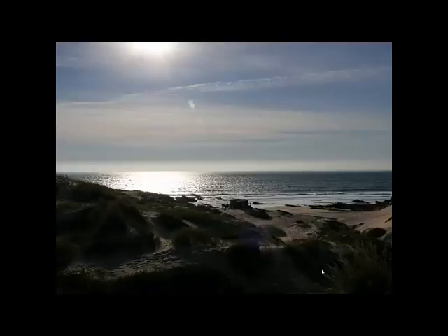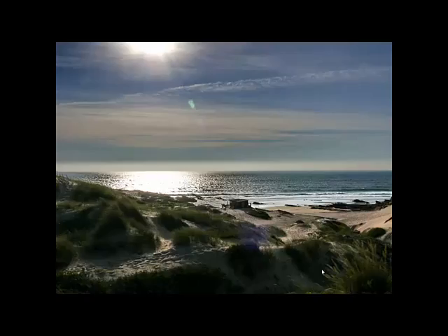This is again the raw image. If I apply image processing now to this picture, it would look like this, and the benefit is now really visible. We see all the details in one picture. We don't have to window, it's all in this picture. The information in black as well as the information in white, or bright in this case. That's the purpose of image processing, to show everything that the image offers in one picture and not having to move any window and level settings around.